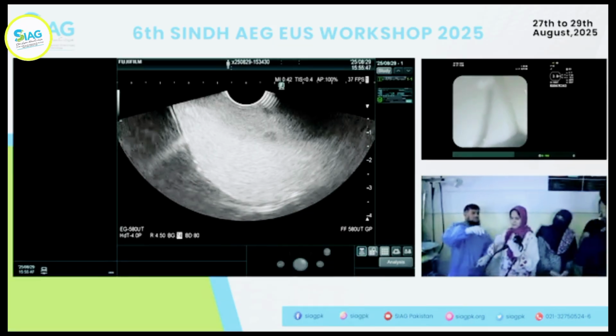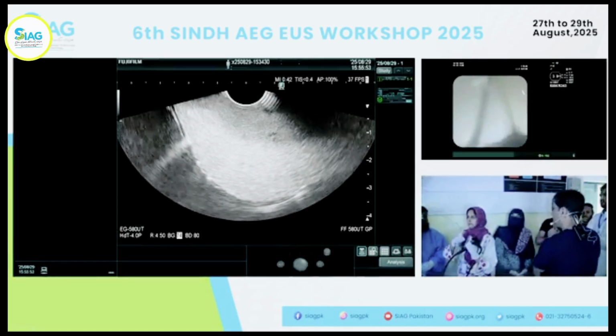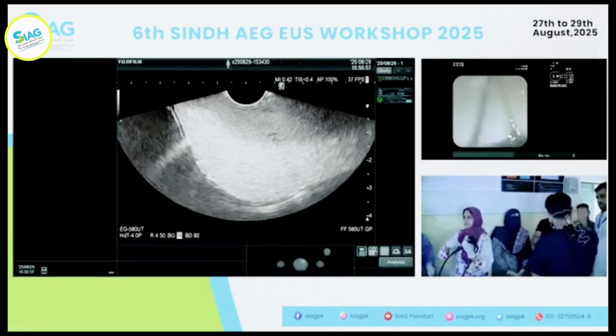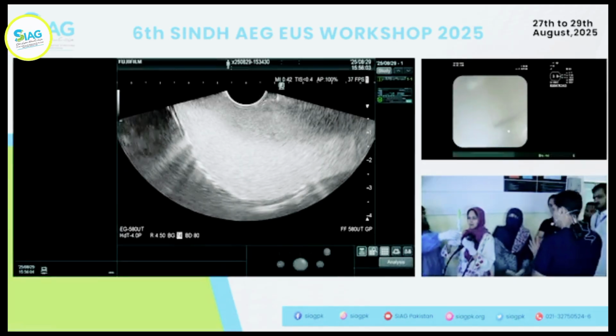So the important thing to remember with liver biopsies: number 1, no fanning. Number 2, 3 actuations. So in, out, that's it. No fanning. Same space.